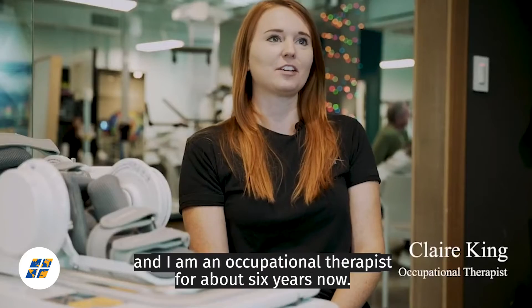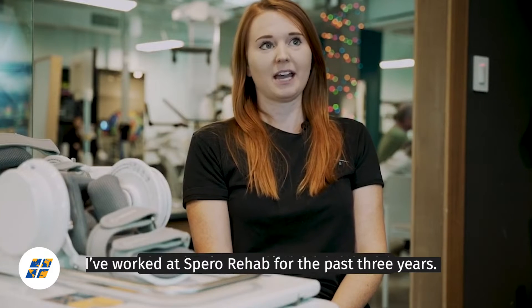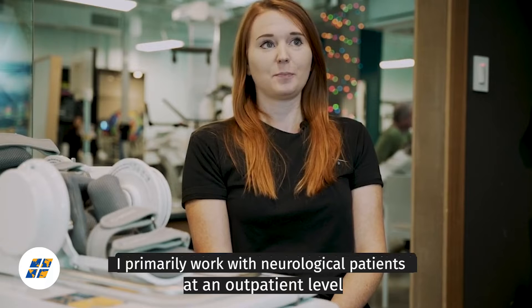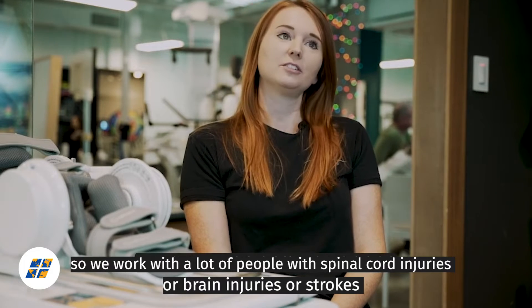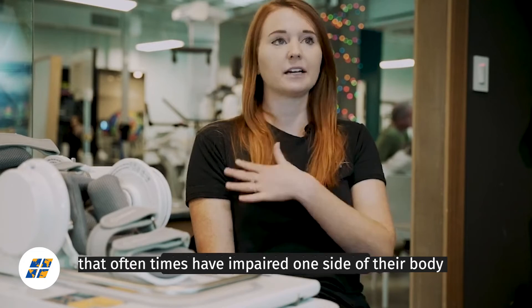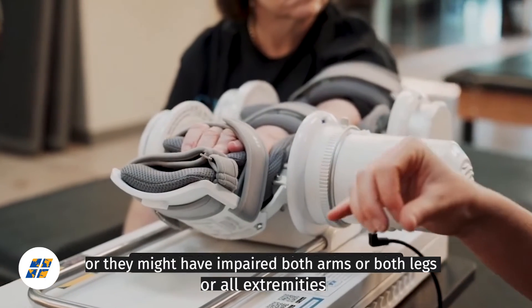My name is Claire King and I've been an occupational therapist for about six years now. I've worked at Spiro Rehab for the past three years. I primarily work with neurological patients at an outpatient level, so we work with a lot of people with spinal cord injuries or brain injuries or strokes that oftentimes have impaired one side of their body, or they might have impaired both arms or both legs or all extremities.